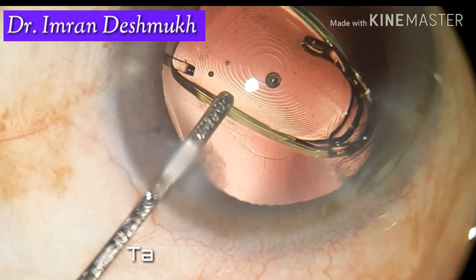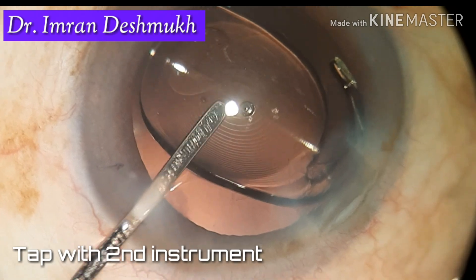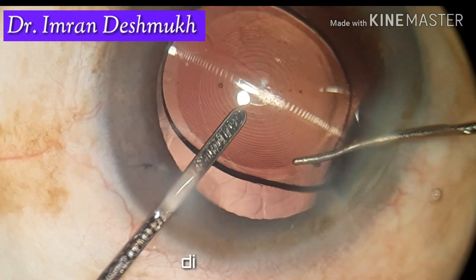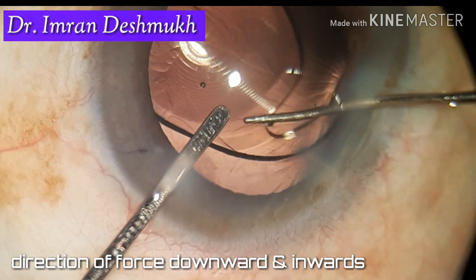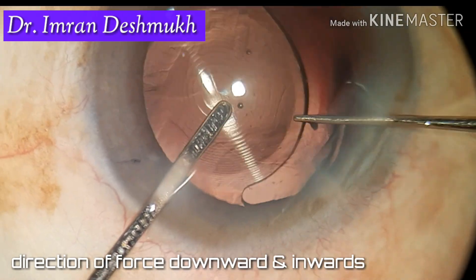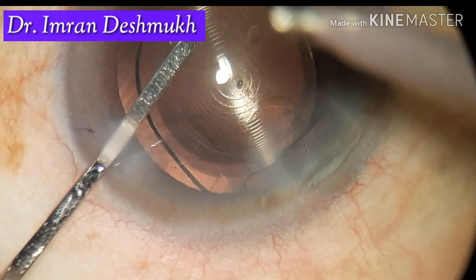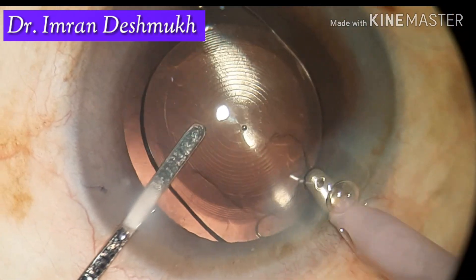The leading haptic should be in the bag and the trailing haptic can be anywhere. Tap the center of the IOL with your second instrument — you can use a T-pusher or a Y-pusher. Engage it at the optic-haptic junction and use a downward and inward direction to place the IOL in the bag.